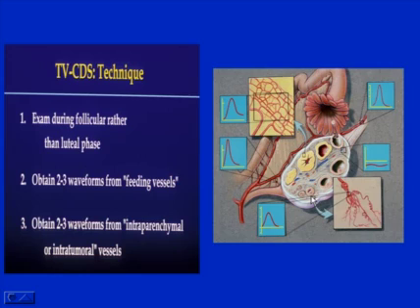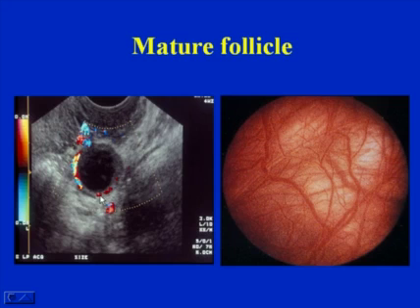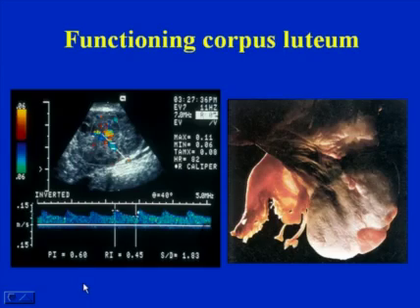And of course, where there's no follicular development, the vessels are very tightly coiled, and the impedance value is very high, as opposed to areas where there's a vascular arcade in a corpus luteum, where there's increased diastolic flow. We can see this visually here in this mature follicle, where there's vascularity around the periphery and a hypovascular space, which is an area where ovulation is going to occur.